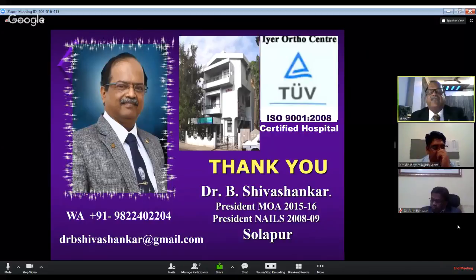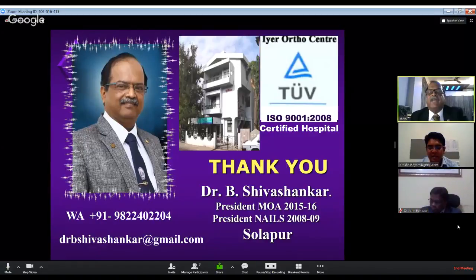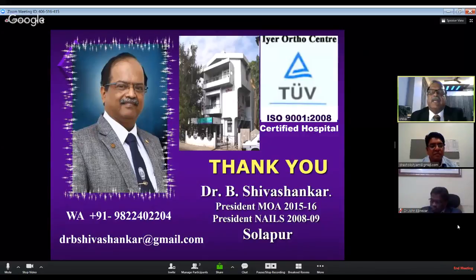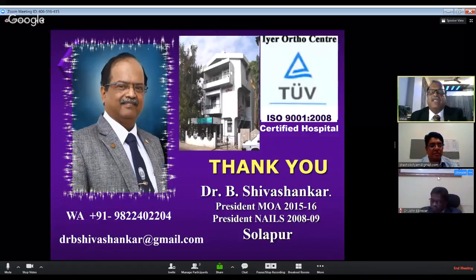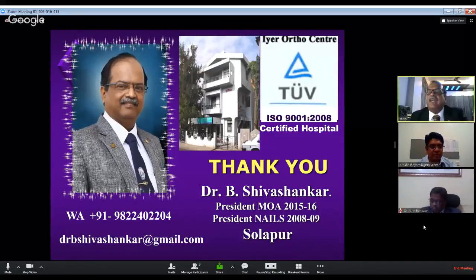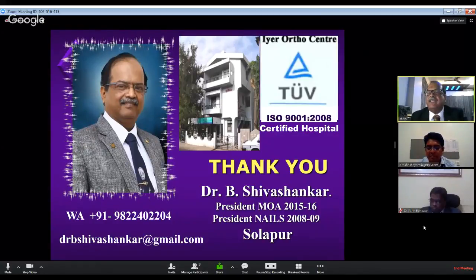Actually, this I discussed in detail in the first webinar, on how to avoid common mistakes. What happens is, if you insert the nail through the fracture site, that displaces the fragment laterally. So always try to fix this fracture with K-wires, and only then ream it. There should be some counter support, which is required. This counter support when you're reaming can be given only by fixing the fracture with K-wires. Without fixing the fracture, if you just ream it, the shaft gets lateralized.